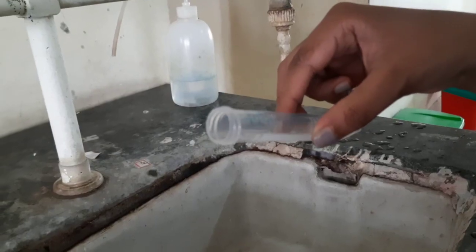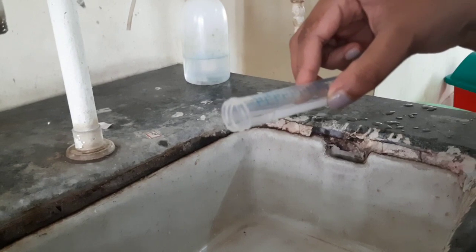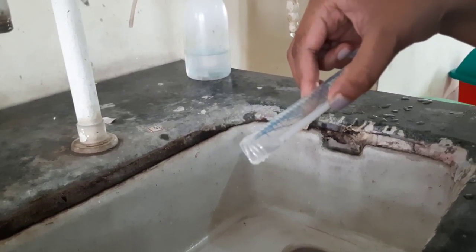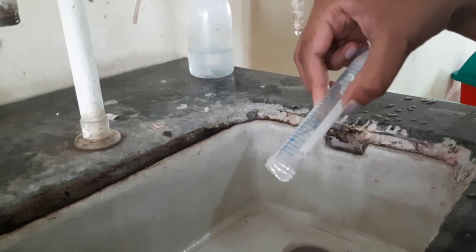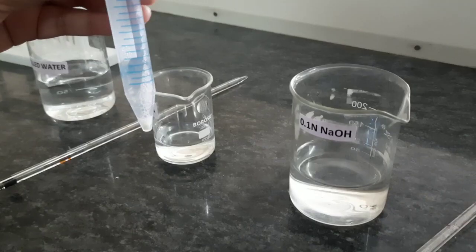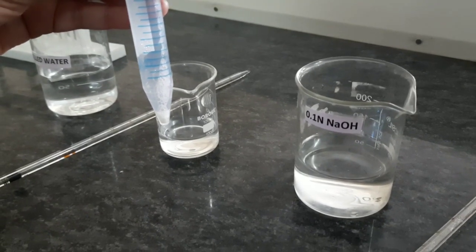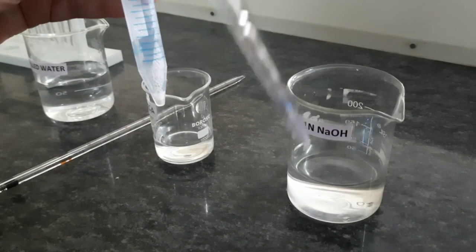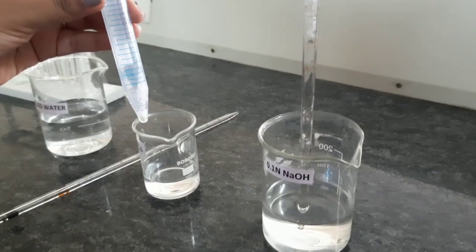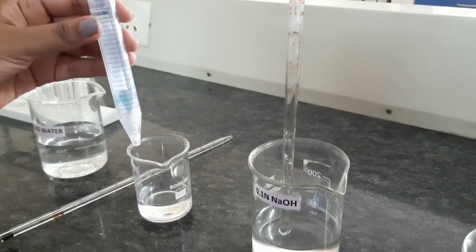After the completion of centrifugation, you can see the pellet has been formed. We will decant the supernatant and take the pellet. Carefully you have to do this process so we do not lose the pellet. So you can now see that we have obtained the pellet. To this pellet now we will add 0.5 ml of NaOH. It is 0.1 normal NaOH. 0.5 ml of NaOH will be added to this pellet to dissolve the pellet.